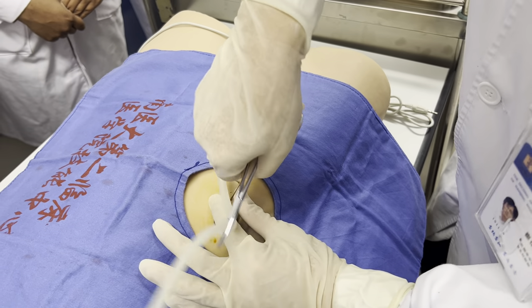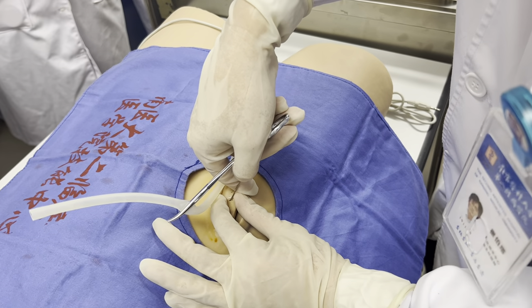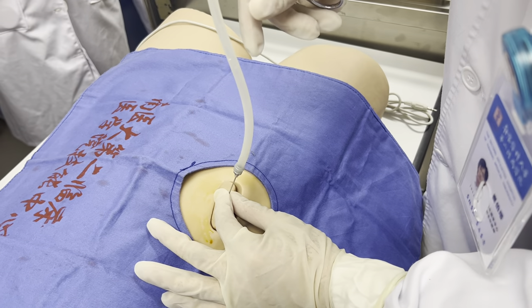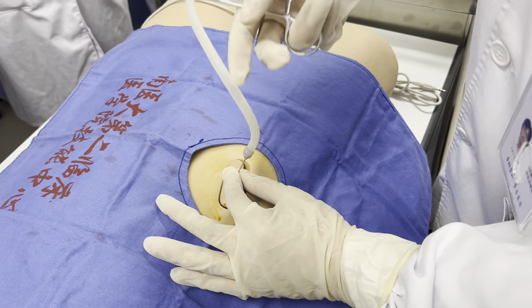When we advance — when we puncture — until we feel an empty sensation, which means that the needle has entered the cavity. And we will see the fluid or solution come out.